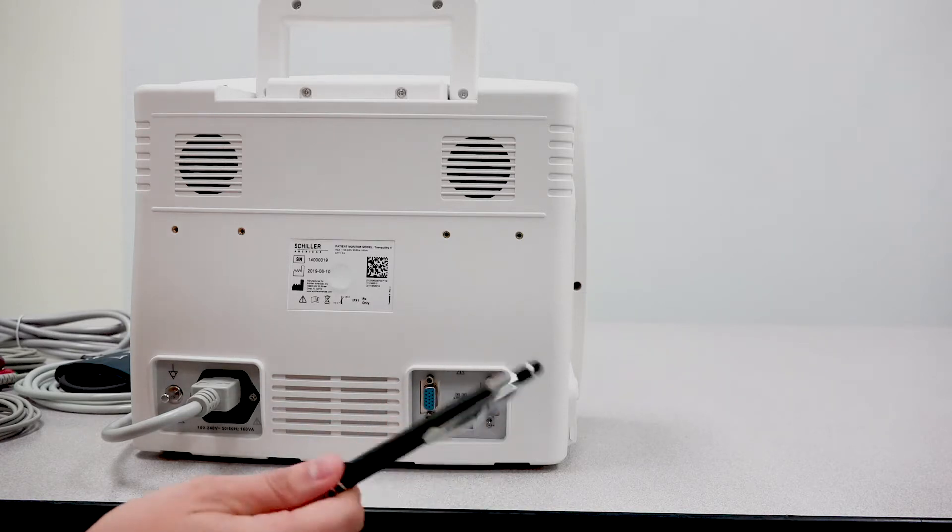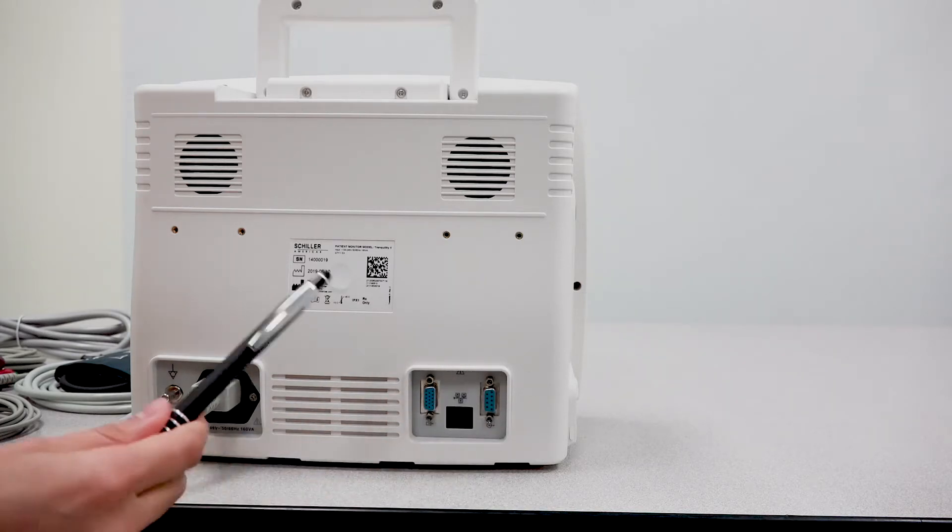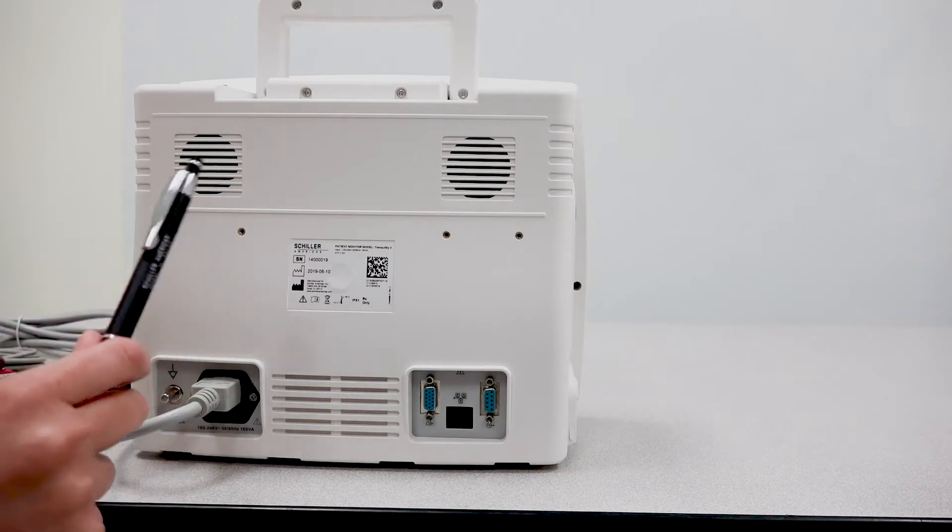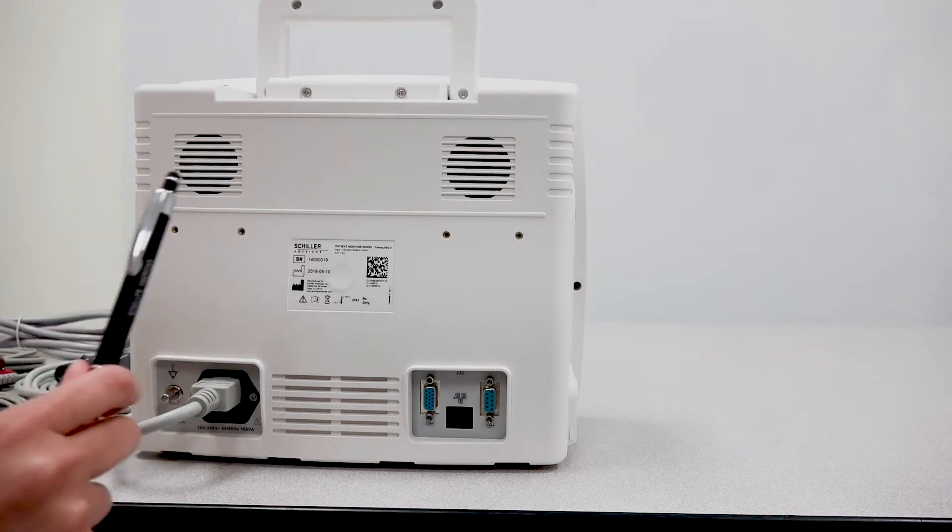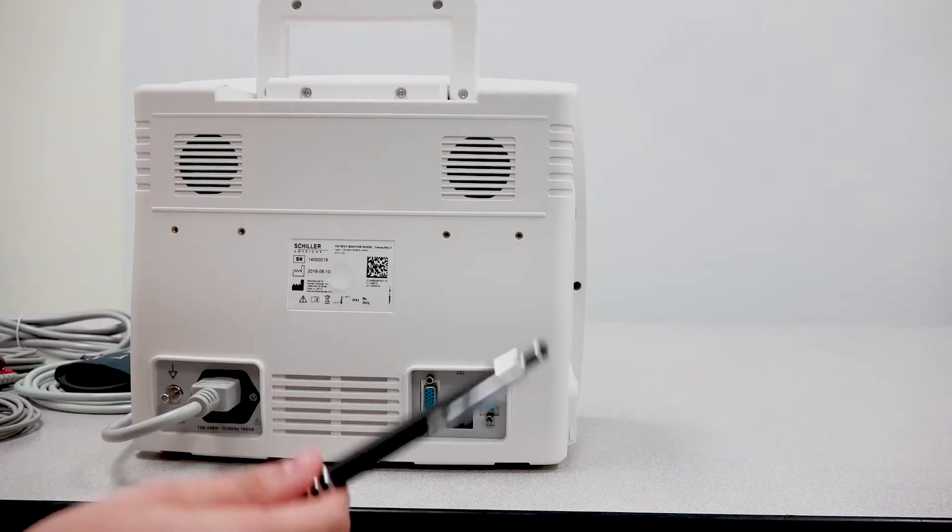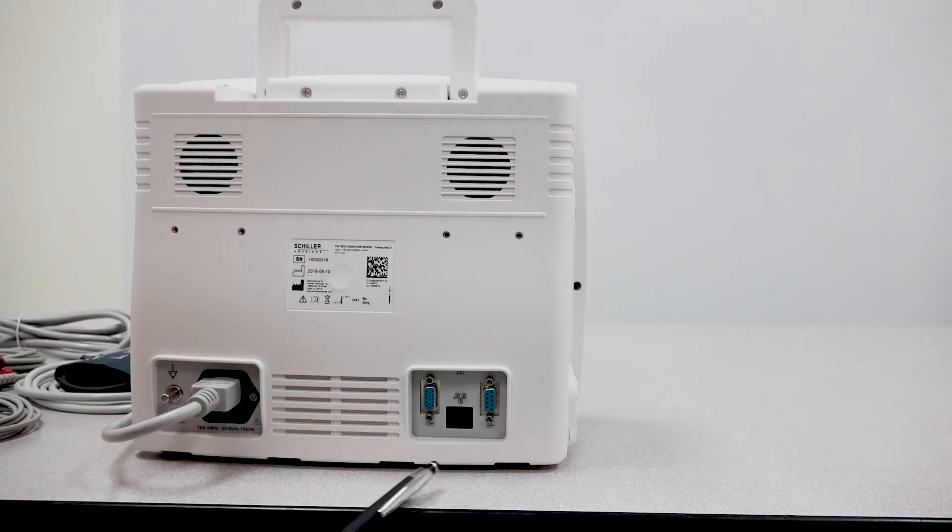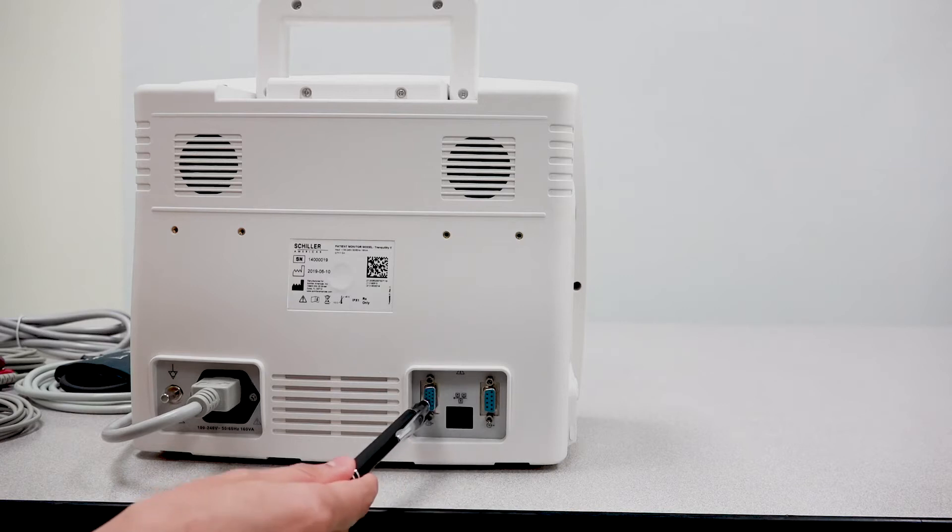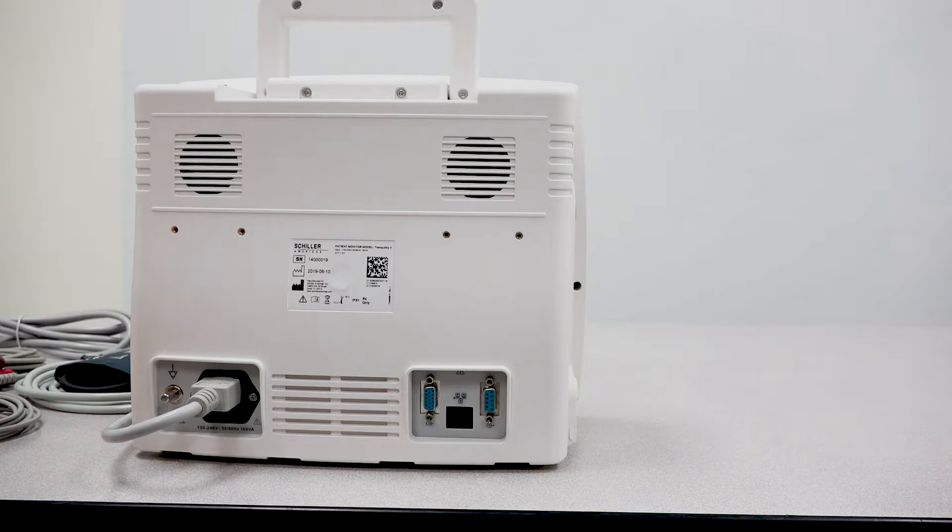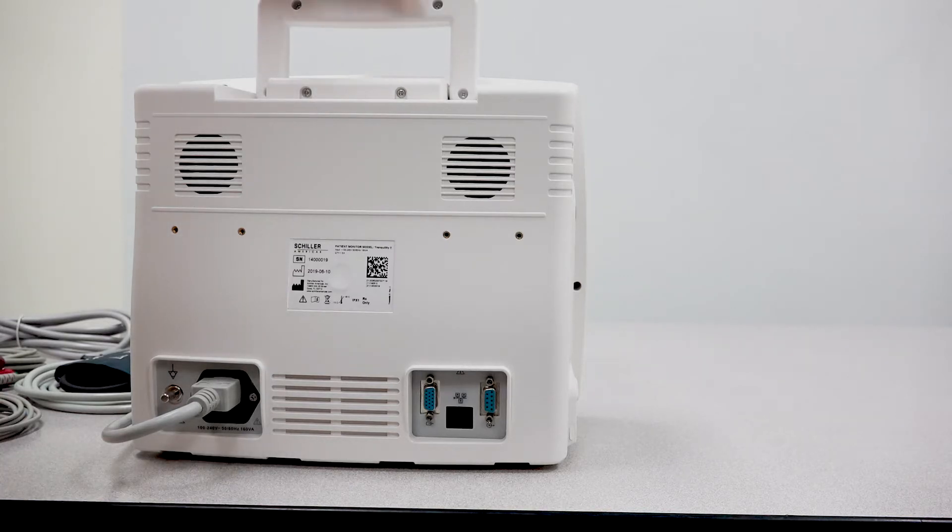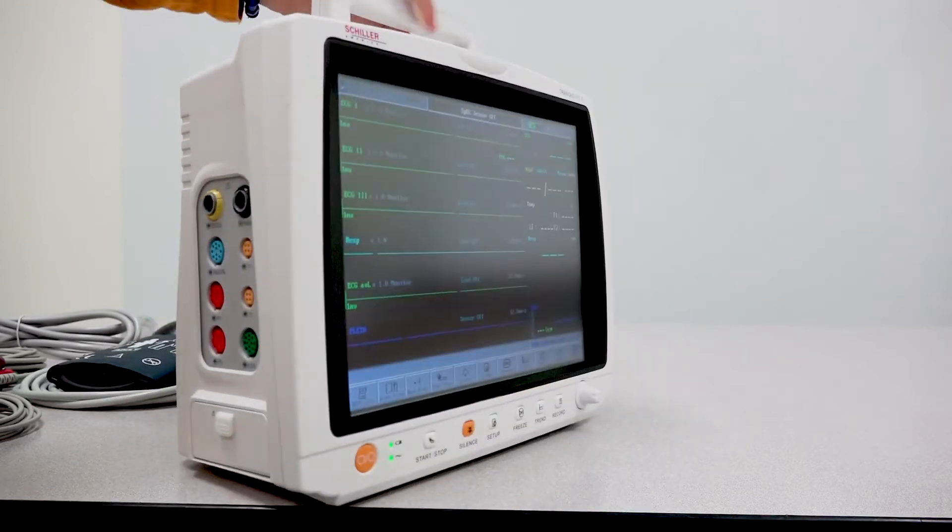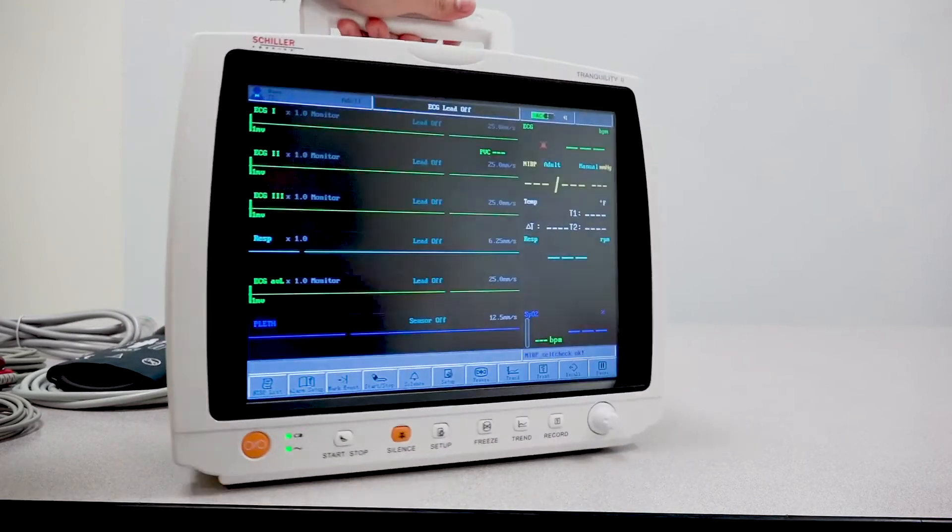One RS-232 port is to connect a Wi-Fi transmitter so that you can send wirelessly the data over to a central station. Or you have the other RS-232 port, which is the ability to connect an external monitor.